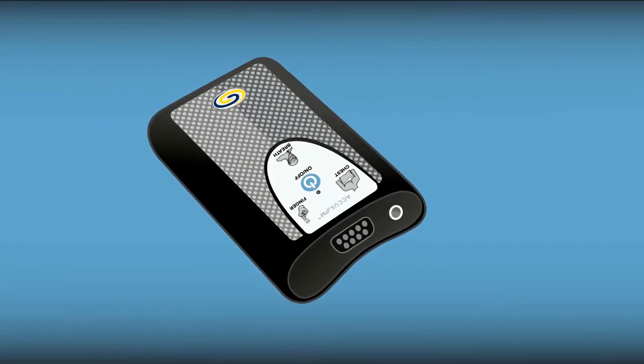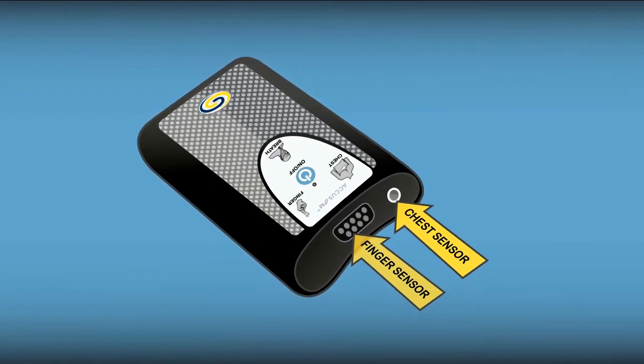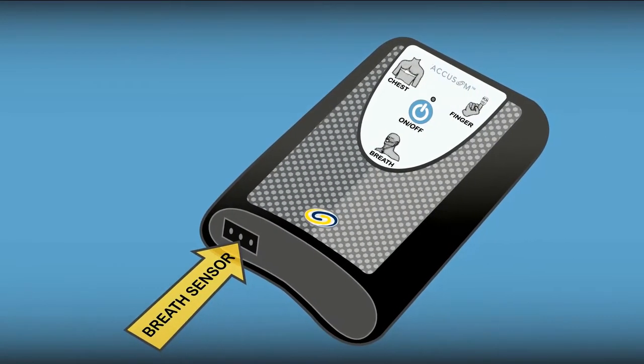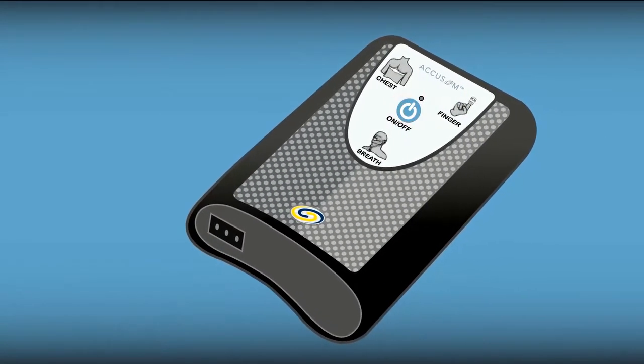The top panel has openings to attach the finger sensor and the chest sensor. The bottom panel has an opening to attach the breath sensor, and the on-off button is on the front panel.